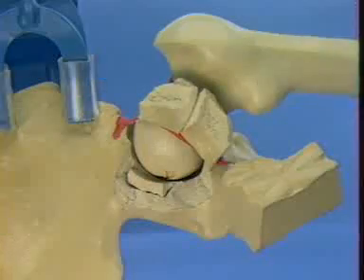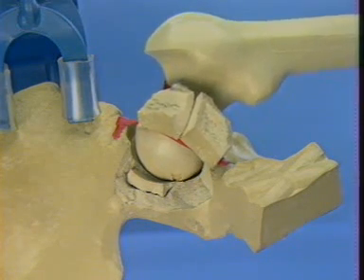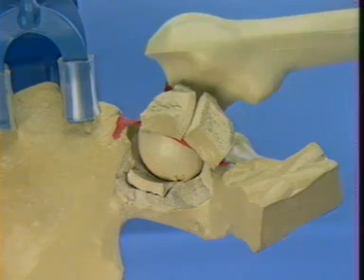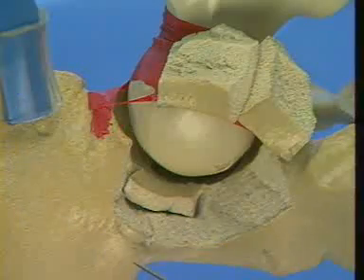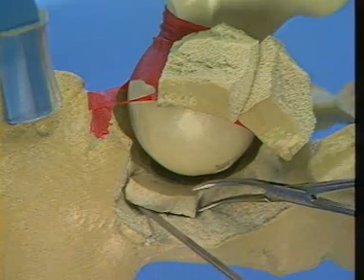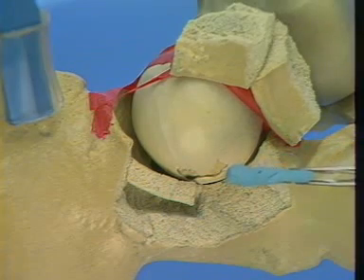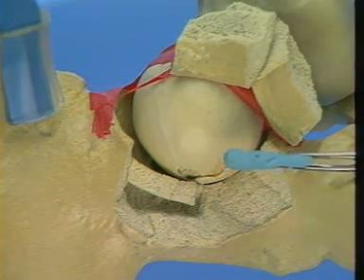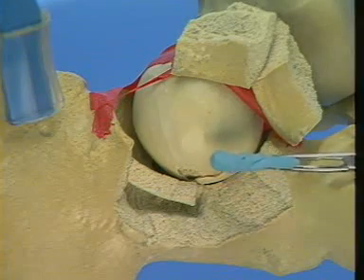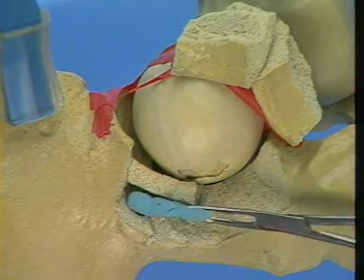The femoral head was reduced into a congruous position with the acetabulum and used as a mold for reconstruction of the posterior wall. An osteotome is used to elevate the impacted segment of cartilage and cancellous bone. Bone graft can be obtained from either the pelvis or proximal femur and is usually necessary to buttress a defect following elevation of the impacted segment.